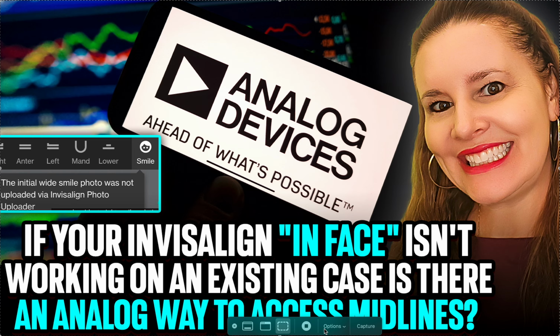But I do know you have to use the app on the iPhone or the Android, the actual Invisalign app. There's an Invisalign practice app, and there's the My Invisalign or the Invisalign patient app. Patients use the patient app if they want to be doing virtual check-ins. They don't have to. And by the way, just watch out because when you get your patients all excited about the virtual check-ins, there's a lot of data that Invisalign can get from them. Not all patients are okay with that. That is the one thing you have to keep in mind with the whole virtual process: some patients are very uncomfortable about just having their data out there. So not everyone's going to be cool with the virtual process.